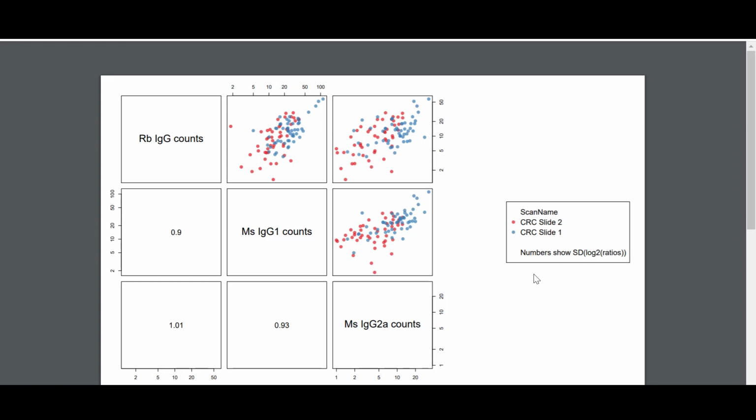Lastly, beyond background stability, we also look for at least 2 IgGs that are well correlated, such that we can take their geometric mean to represent background. In this particular study, it is clear that the background is below 20 for many AOIs, and additionally, likely as a consequence, these negative IgGs are less stable and lack a strong enough correlation between at least 2 of them to justify background as a normalization method for this data.